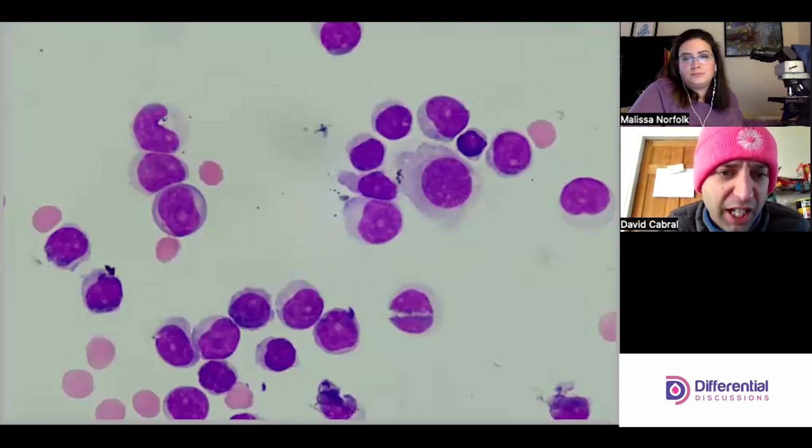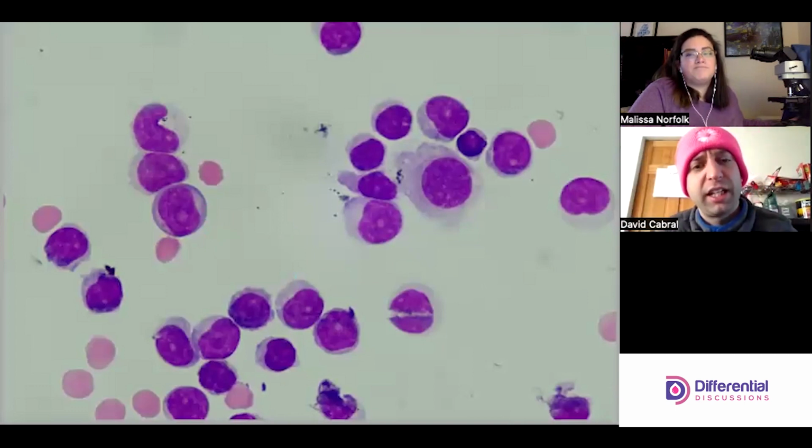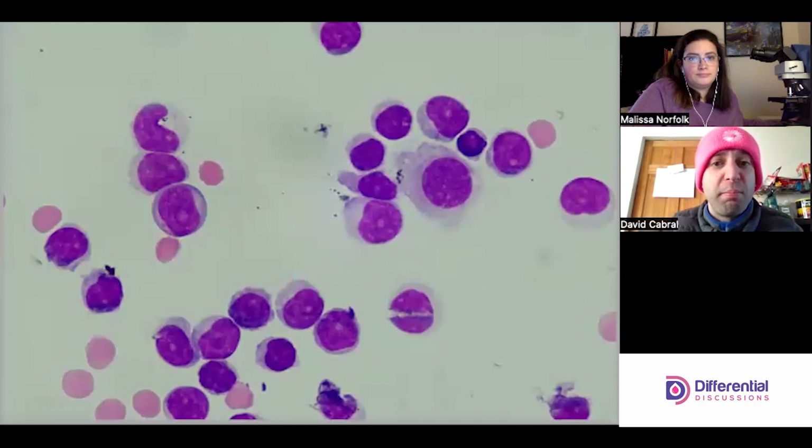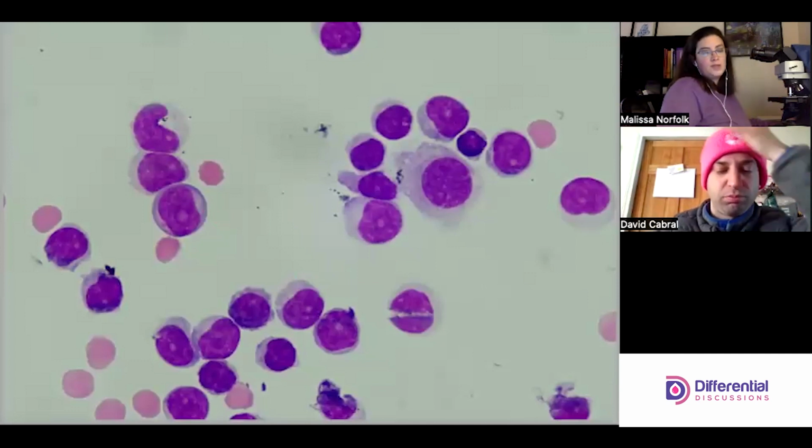And then we see that pretty blue and the differential staining, and especially given the context and everything else on the slide, it just looks like it's reacting to something. Your body can have an immune reaction to malignant cells, right? So that's not necessarily a crazy thing to see.